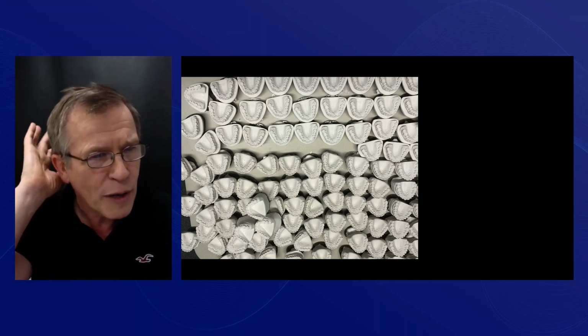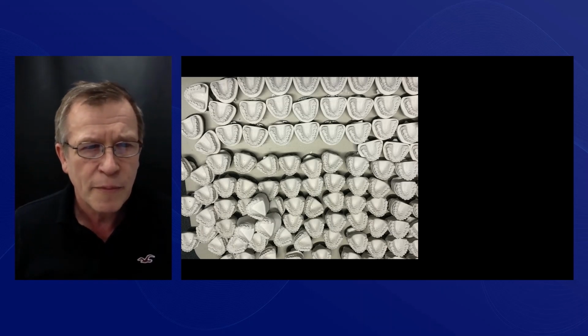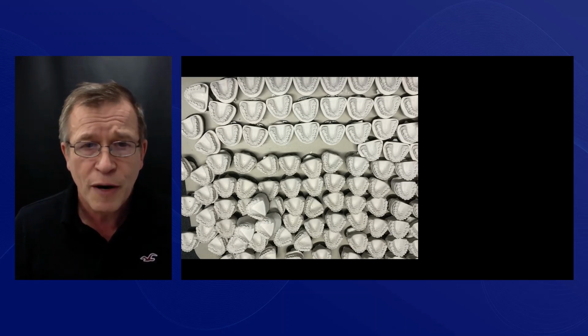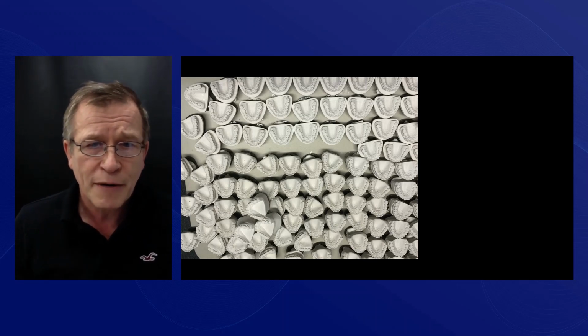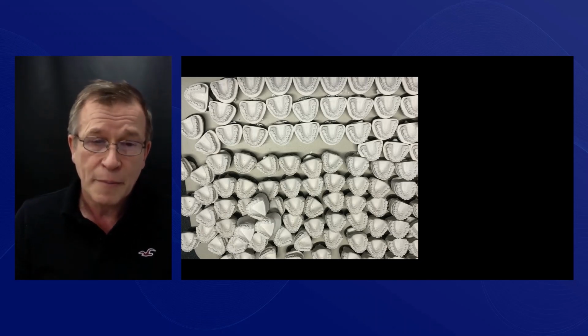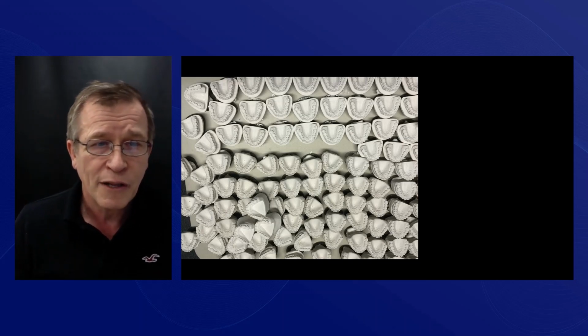Sometimes I forget to talk about the simple things that we do, and taking those digital impressions and being able to use those to communicate with the patients is such a bonus. My background is a lot of functional dentistry, and we would take models, take impressions, then we'd have to cast the models, then we'd use a facebow to mount the models, and a bite registration to mount the models, and it used to take a lot of time and a lot of effort.